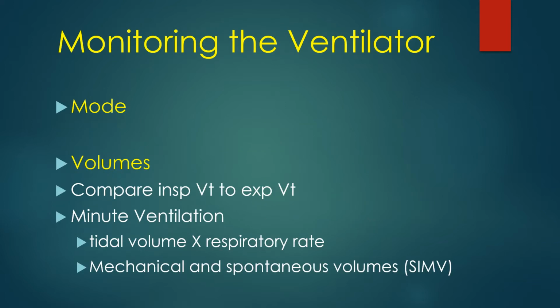So let's first talk about the ventilator. We're going to check the ventilator, and we're going to document all of this stuff that we see on the ventilator. We're going to monitor the settings on the ventilator, what is set, and that should match exactly the doctor's orders. So what's on the ventilator should match exactly what you're documenting, which should match exactly what the doctor's orders are. So in the first section, when you're monitoring the ventilator, you will have what is set on the ventilator.